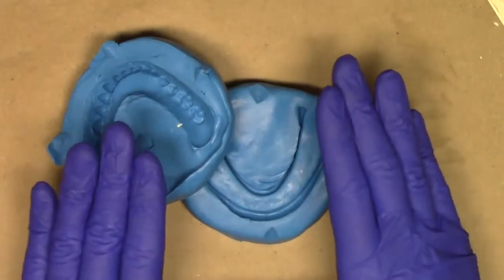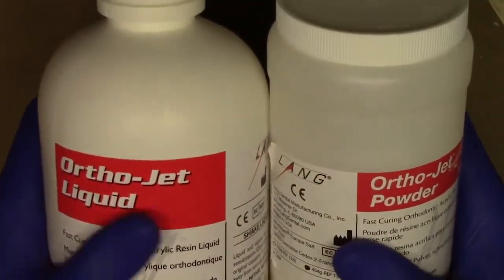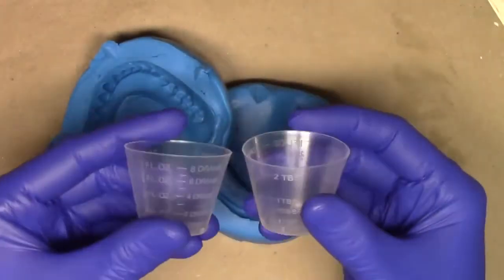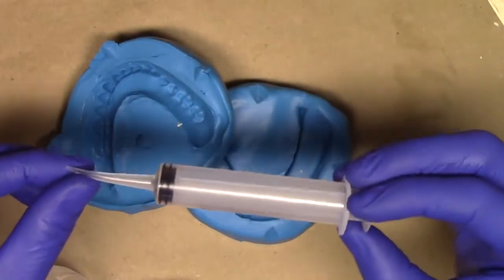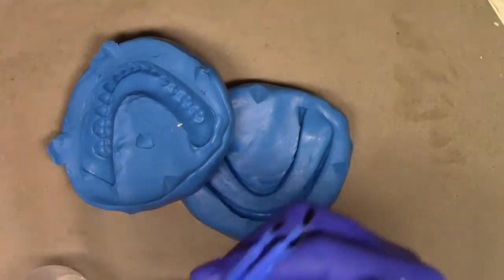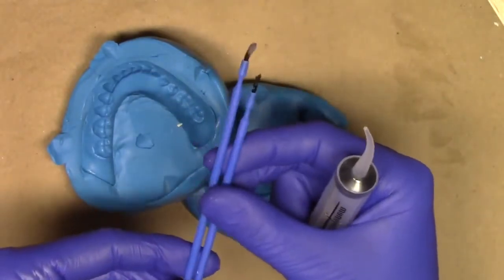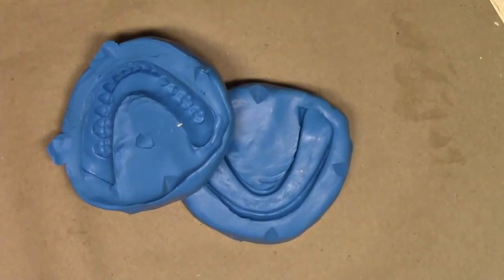The first step is we need to select our orthodontic resin. I prefer this particular type. It's just an Orthojet liquid in powder. However, any sort of commercially available clear orthodontic resin is more than adequate. You will also need a couple of these disposable dappen dishes, as well as a monoject style syringe for injection, as well as some sort of mixing device. And also, just for good measure, I like to recommend using some of these little brushes to help me put in the clear orthodontic resin. Step one is we can go ahead and put those materials to the side.